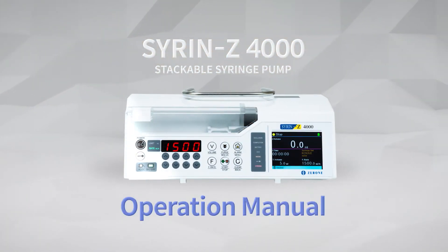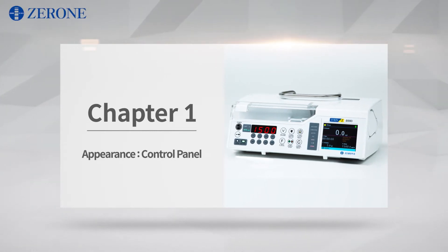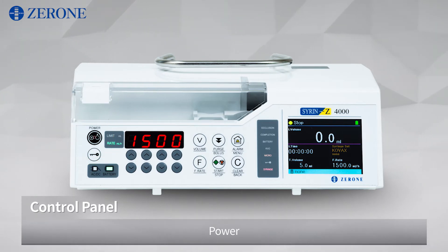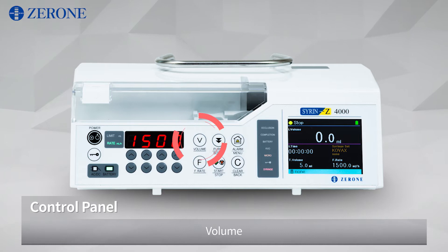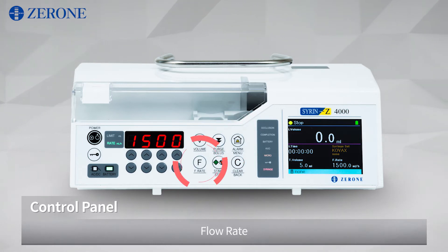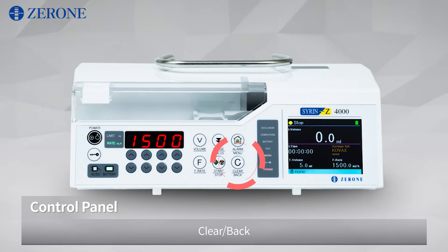Syren Z4000 Stackable Syringe Pump. Let's see the soft keys one by one: Power Key Lock, Increment and Decrement Keys, Volume, Purge, Bolus, Alarm, Menu, Flow Rate, Start, Stop, Clear, and Back.